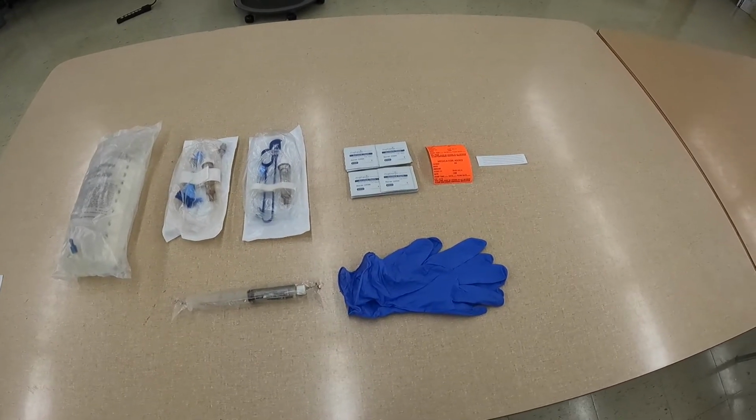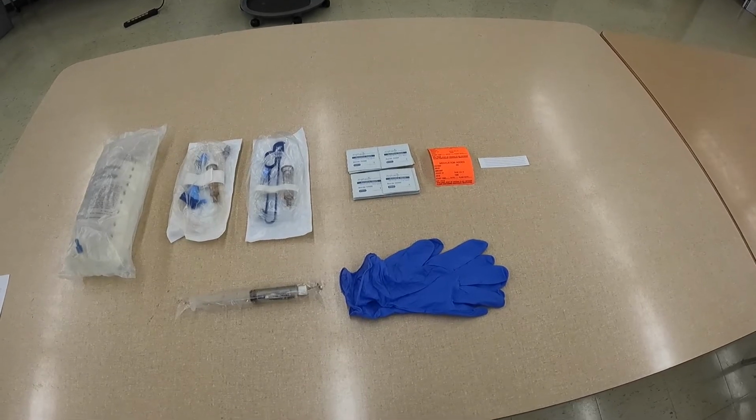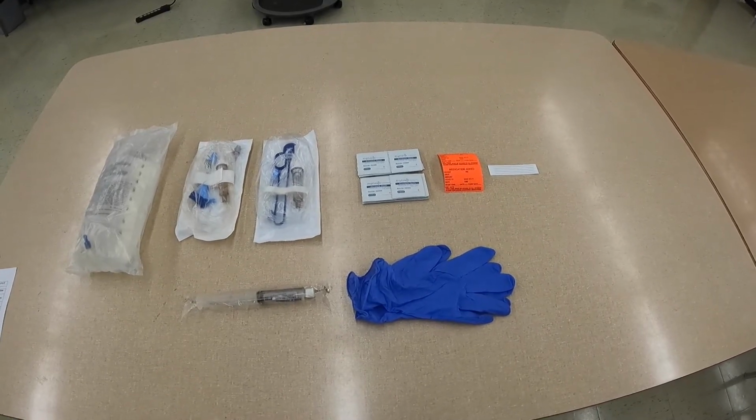Once you've verified your orders in the EMR, you're going to go ahead and gather your supplies. To your left, you have the IV fluid, which per my order is 0.9% sodium chloride. Then we have our IV tubing.